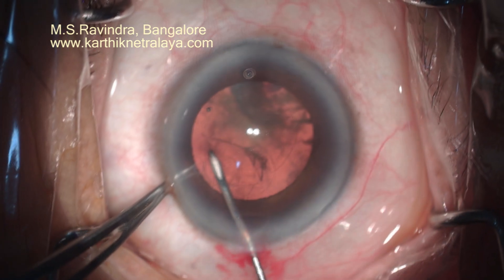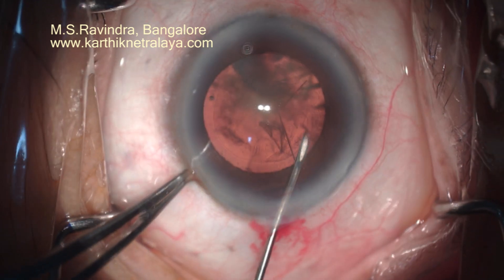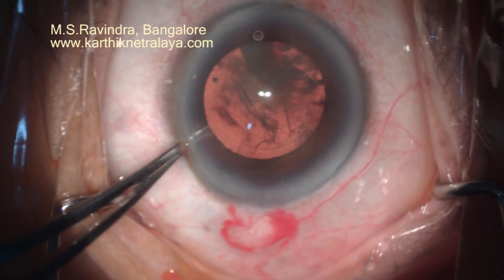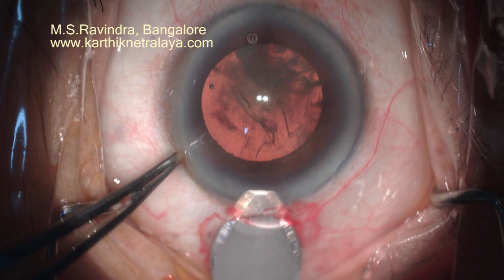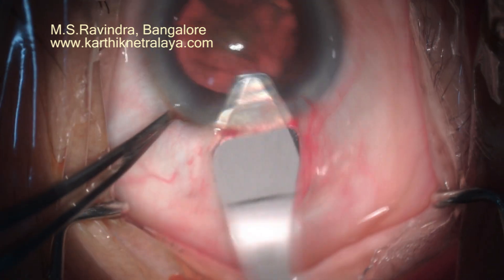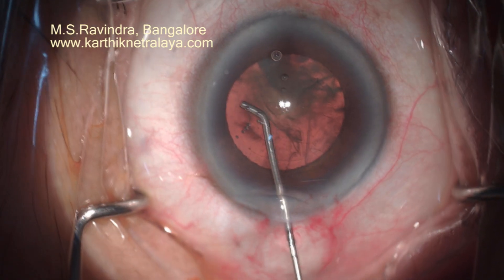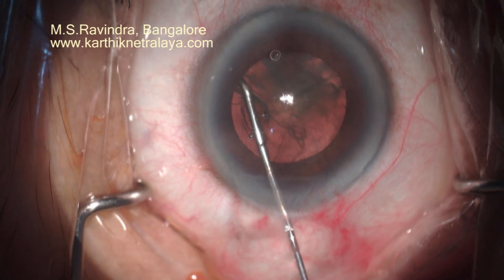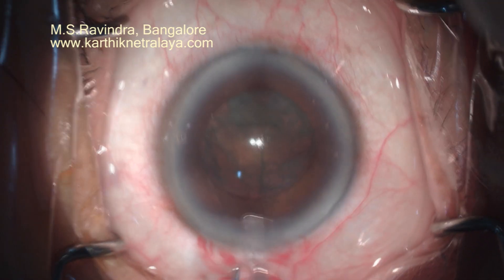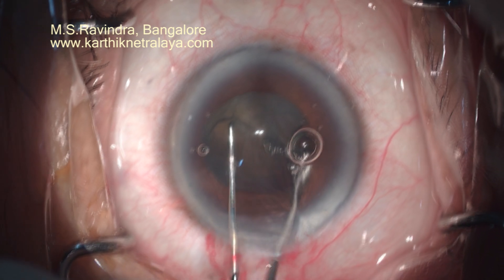Rhexis can be well designed to whatever size you want. There are no corneal striae because the pinpoint entry means there is no overstretching. When using a 2.8 mm keratome, apply posterior pressure so that you don't have runoff of the peripheral incision onto the cornea. If you apply pressure on the limbus downwards and direct the blunt keratome upward toward the corneal dome, you will have a beautiful rectangular-shaped tunnel.